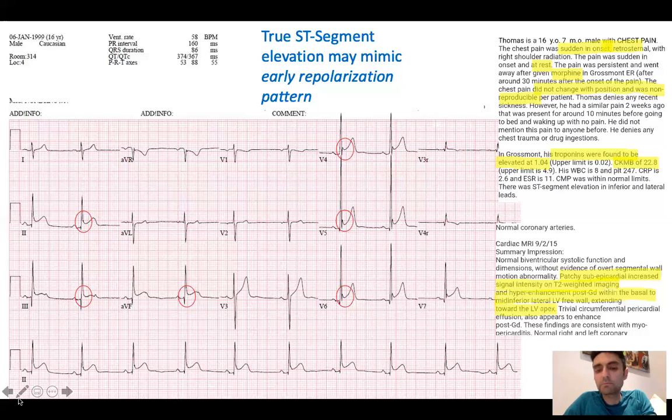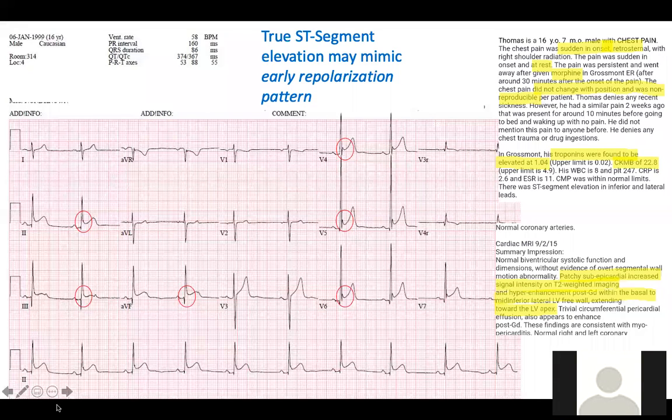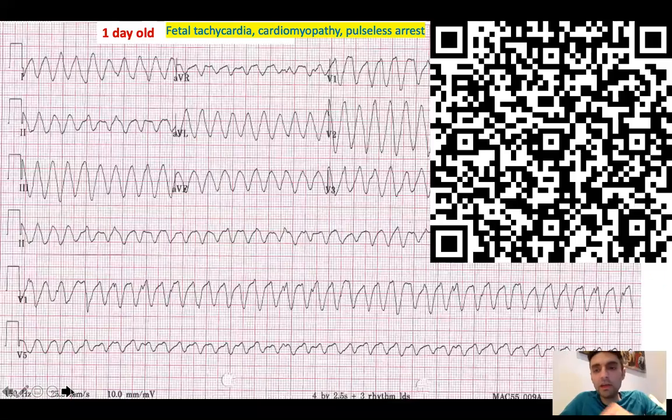Okay, guys. Question? Okay, let's try the other case. Hopefully it works. Let's do this exercise again. Try to submit your answers. Hopefully now it works. I have to figure it out for next time.